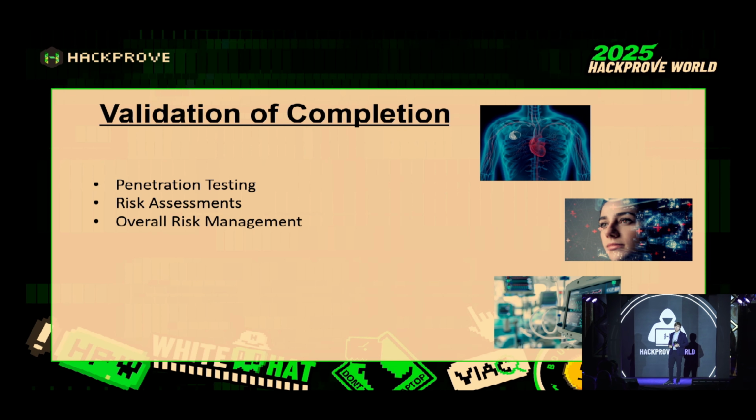A lot of times, and especially with a medical device, it's not necessarily about what the CVSS score is, what the risk is. It's about the impact. When getting a medical device cleared into a regulatory market, we'll just pick the FDA and the USA for an example, they're only going to care about how you can hurt a patient.